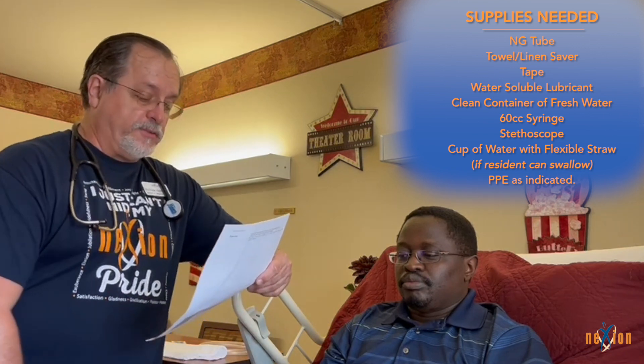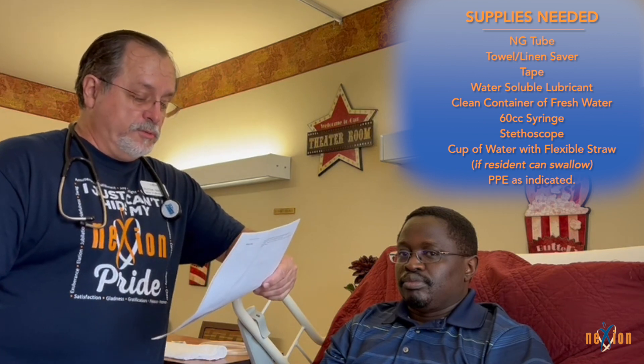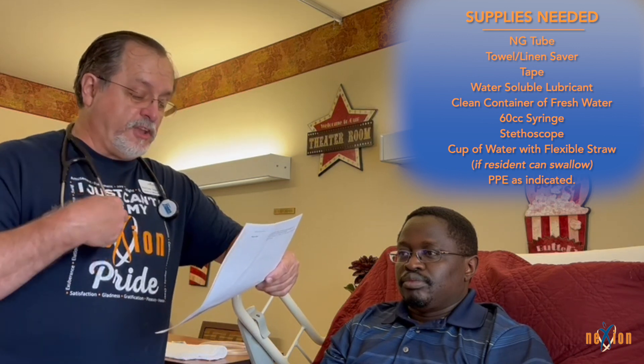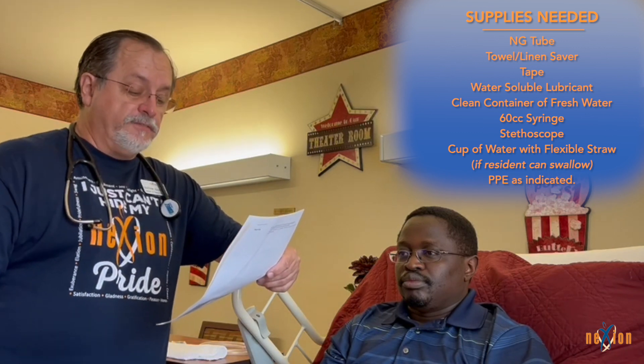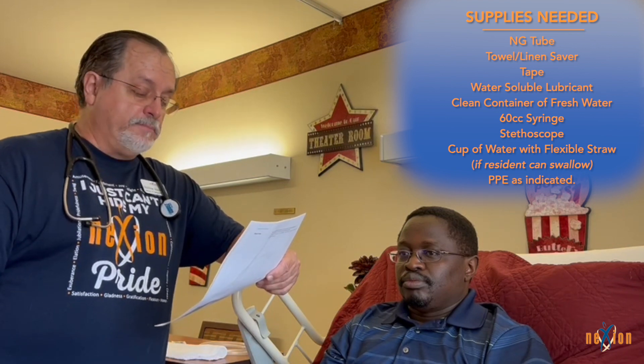You will need the NG tube in the size specified by your physician, a towel or linen saver, tape, a water-soluble lubricant, a clean container with fresh water, a 60cc catheter tip syringe, your stethoscope, a cup of water with a flexible straw if the resident is cognitively and physically able to swallow, and personal protective equipment as needed.